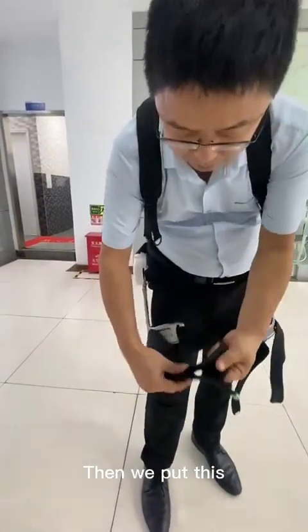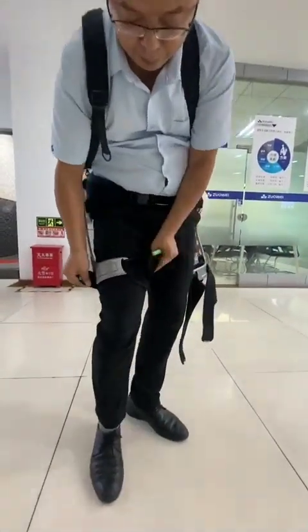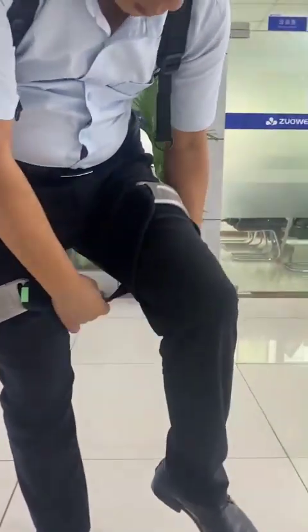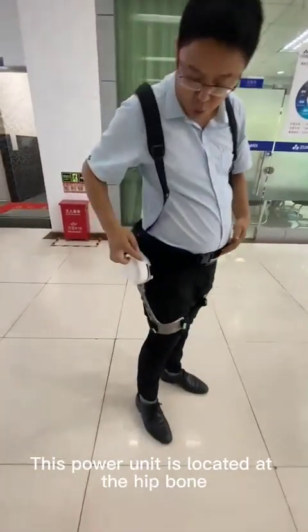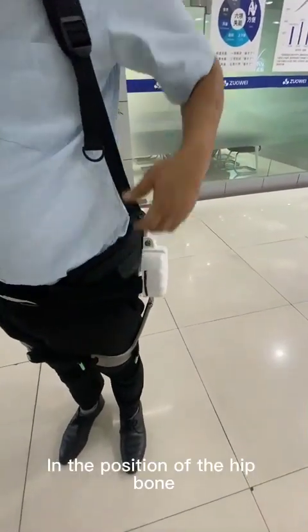Then we put this brace tied to the leg — double-sided tied to the leg. This power unit is located at the hip bone. The same side is also in the position of the hip bone.